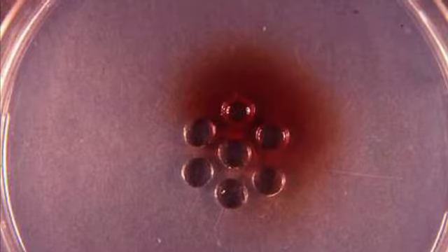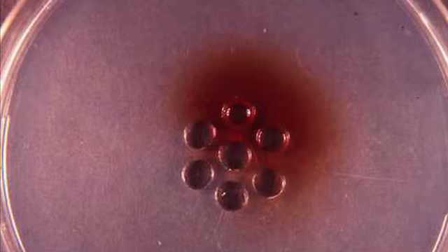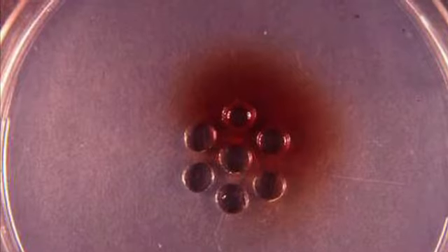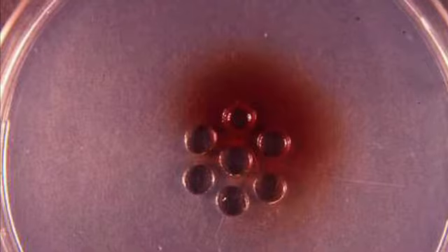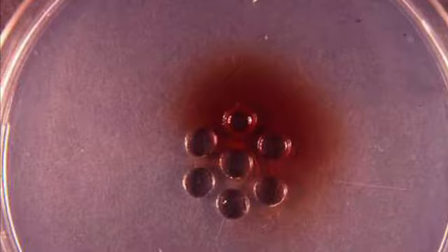So if you look very carefully at the center hole and the hole at about 1 o'clock, you will see a very thin white line in between those two, and that white line is an antibody-antigen reaction, so the antibody is reacting with the antigen. You know that it's anti-deer antibody, so if it's reacting, it must be deer blood. That way you can test several samples at once.